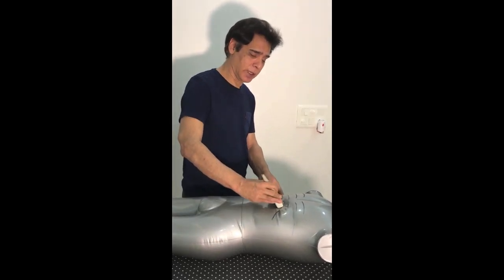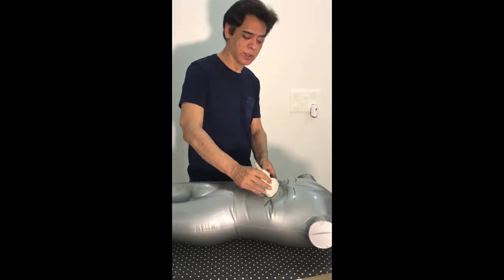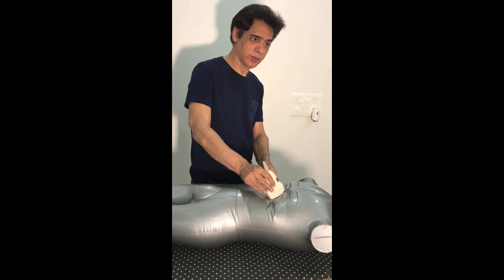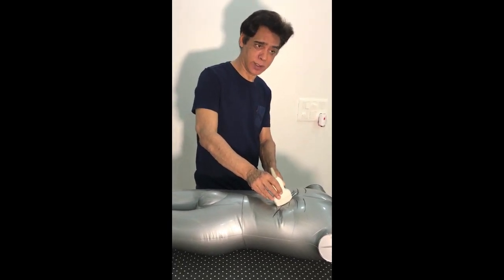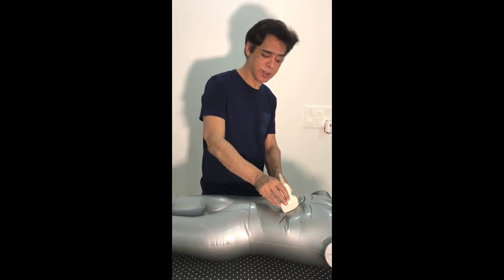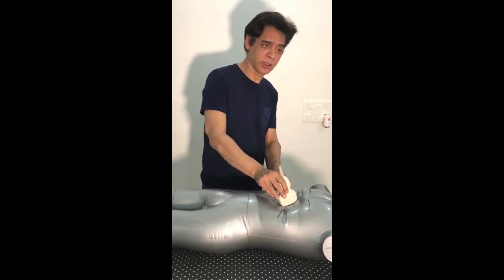Now again I go back and I show you, I am rotating it this way, the right side is going up, I go this way, I get the triangular area of the head of the pancreas, and then a little bit of right and left rotation like this to get the fine focusing.